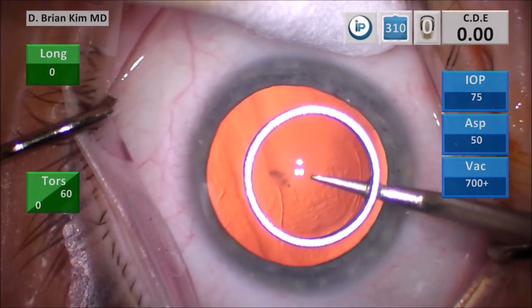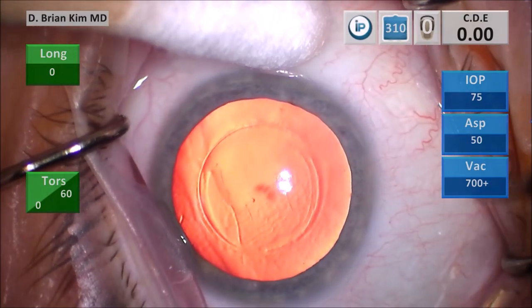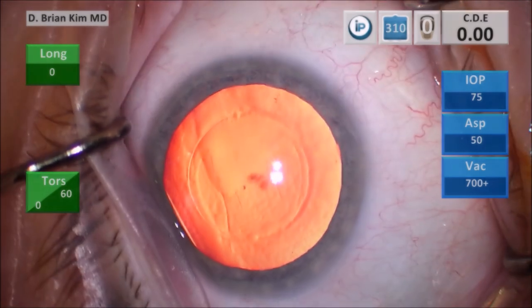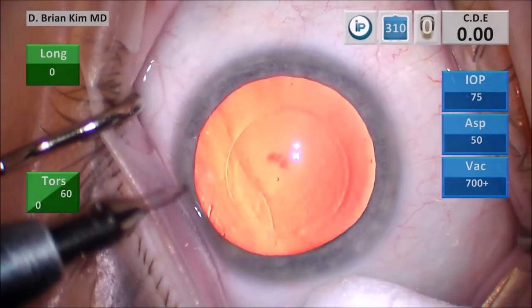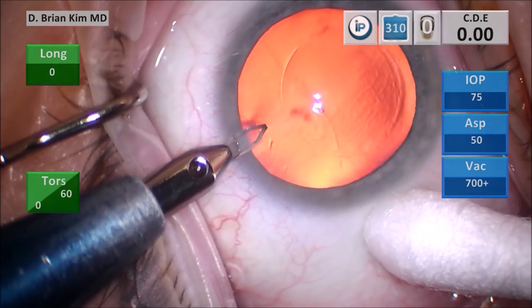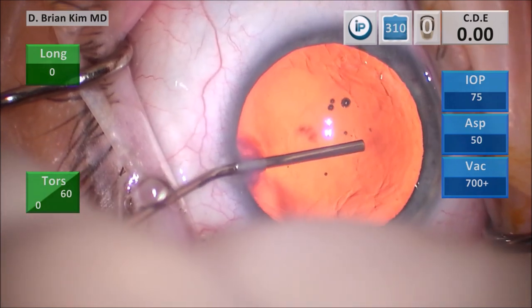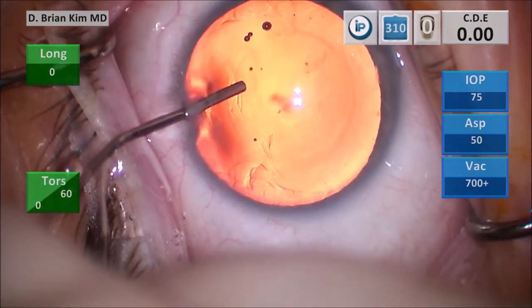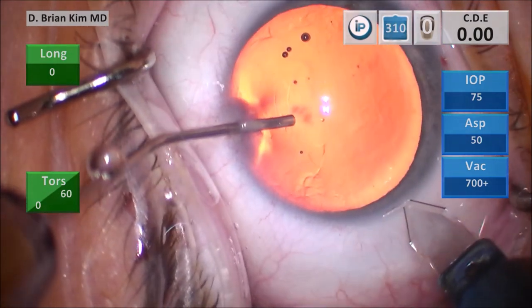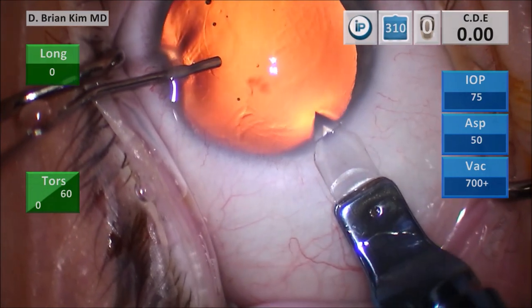Using a cotton tip to help center the eye from my corneal mark, I use the same cotton tip to pull the eye to the side — this helps rotate the eye to the left to allow me to create my paracentesis. I use the same cotton tip to pull the eye towards the right to make my left side paracentesis. You want to make a rectangular flat incision.